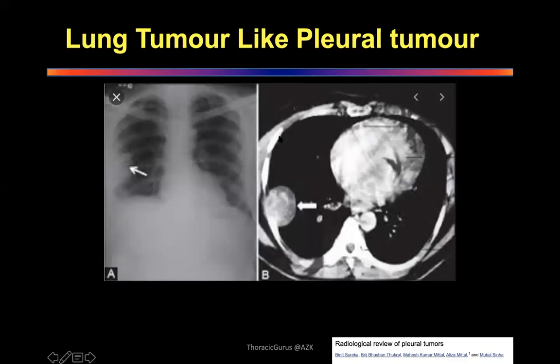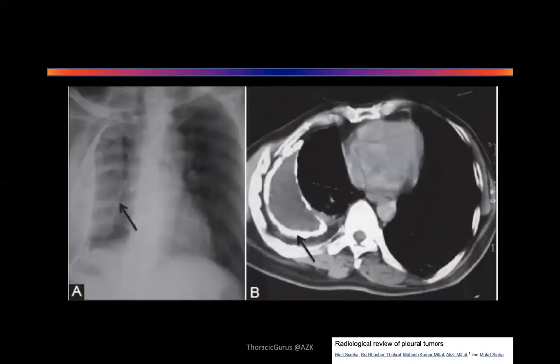So look at this angle. This is very important. The moment you have lung coming on this side and lung coming on this side, the angle becomes acute. And this angle tells you that this is actually coming from the lung rather than the pleura. Okay? All right. Next, Nikhil, take this. This is the split pleura sign.